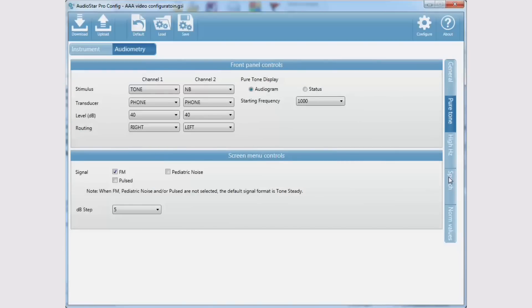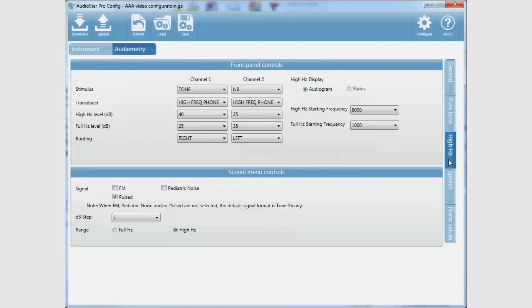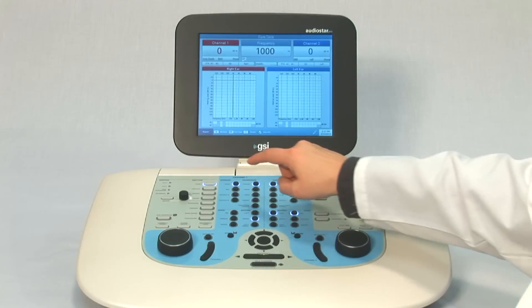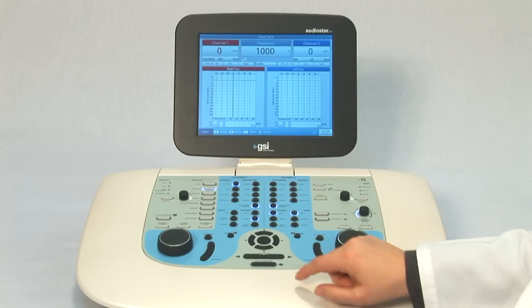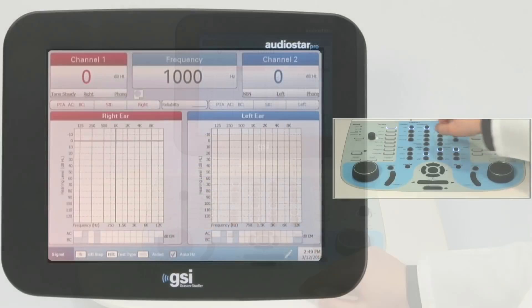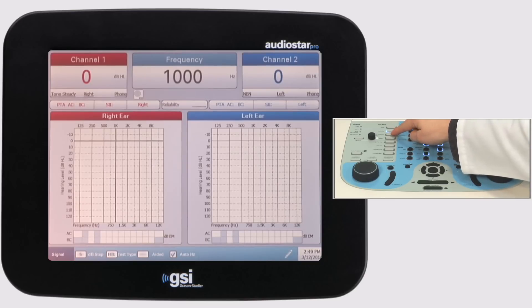These default settings, when used in combination with the one-button, one-function design of the front panel of the audiometer, ensure seamless transition between test types.